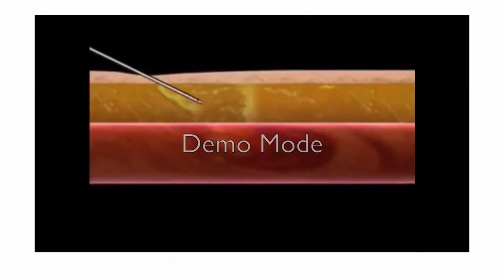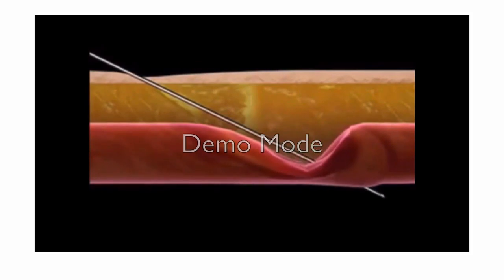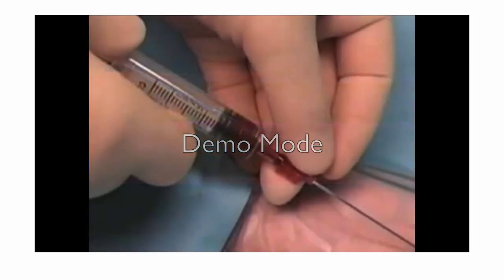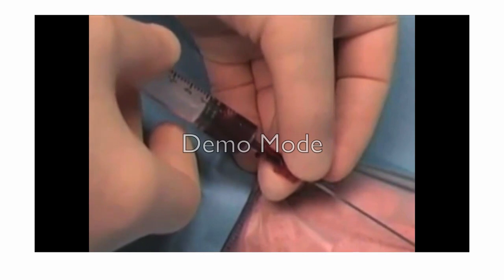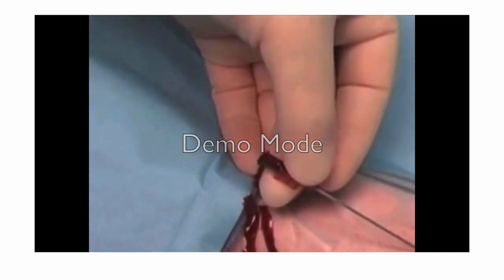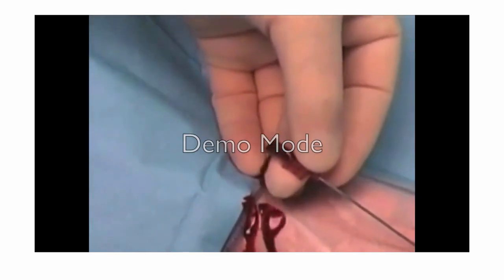Sometimes you will lose the backflow, and this is probably because you have punctured the posterior wall of the vein. Just go back and apply a negative pressure till you have your backflow again. Take the syringe out, and you will notice a nice dark non-pulsatile flow, which gives you a suggestion that you are in the vein.